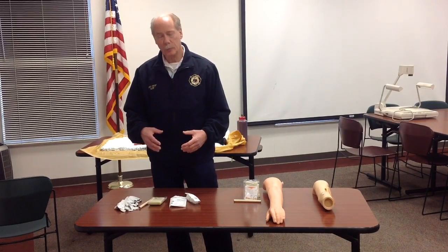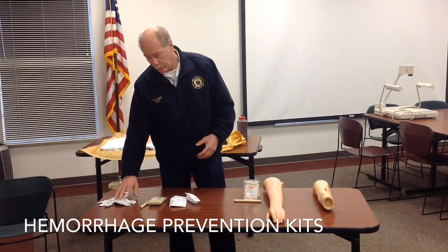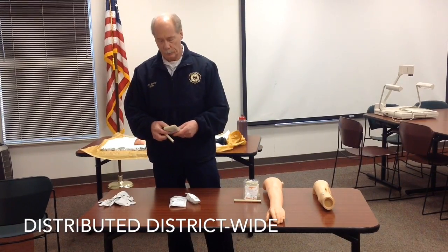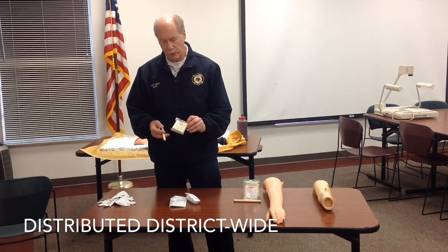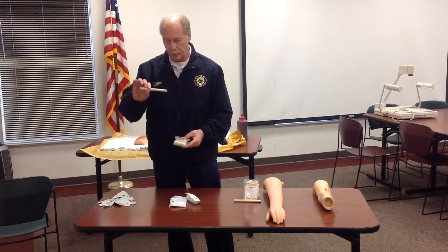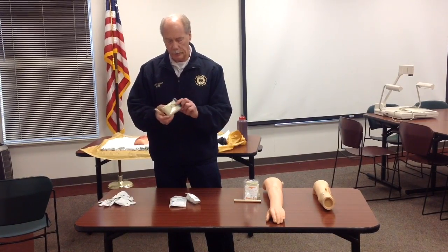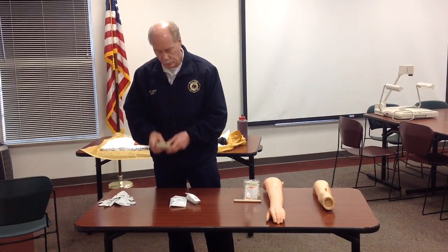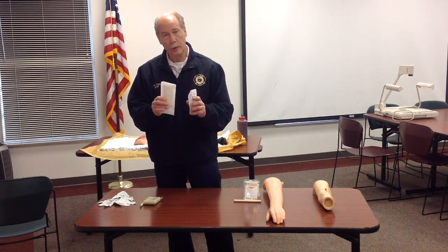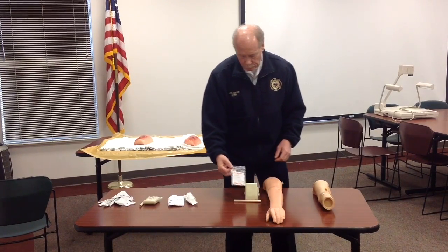The hemorrhage kits we've developed with the schools contain a pair of large vinyl gloves — so if you have a latex allergy, this will not affect you. We also have an improvised tourniquet. As we talked about before, manufactured tourniquets are rather expensive, so the improvised tourniquets allow us to develop a large number and place them throughout the school. You have a stiff item to tighten it with, a triangular bandage, and a ring that slides up and secures it. We also have gauze and a compress for wound packing and direct pressure.